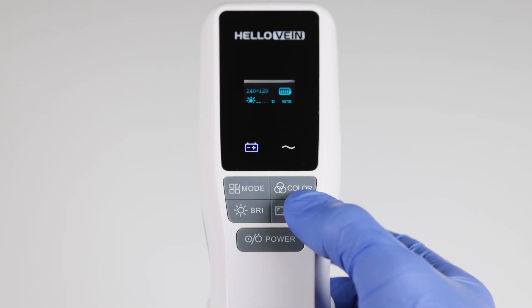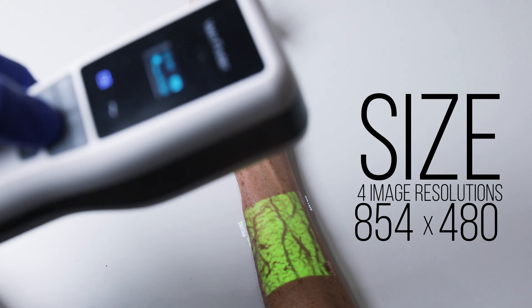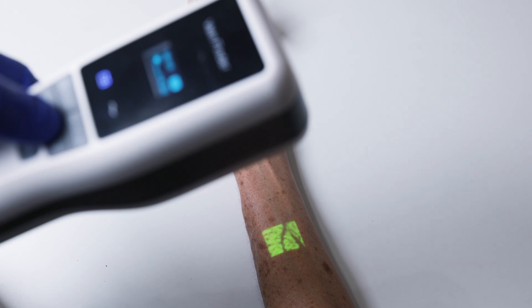The last setting is size. There are four different sizes you can rotate through: large, medium, small, and very small. You should use small and very small for infants and pediatric patients.